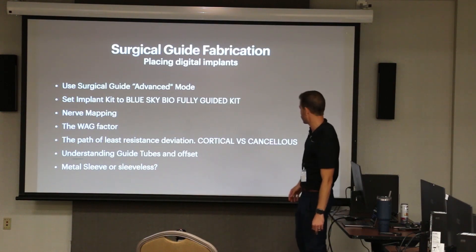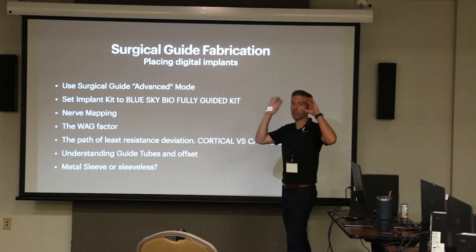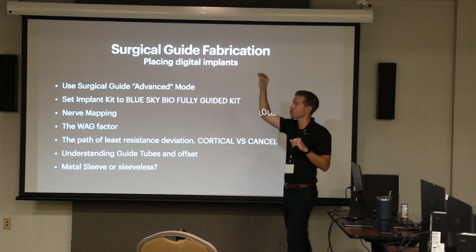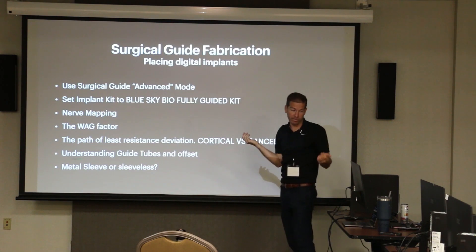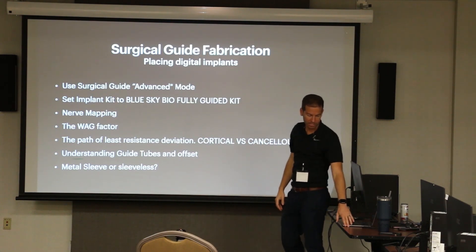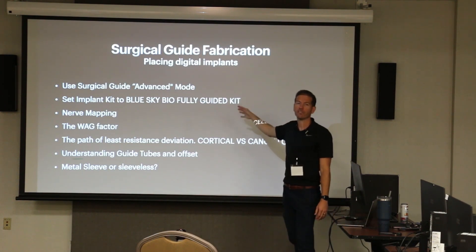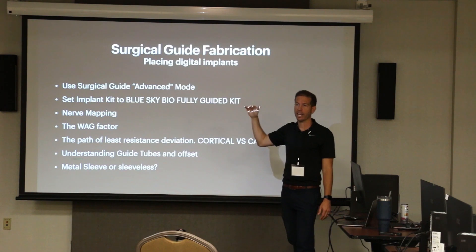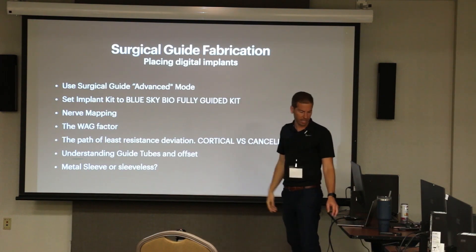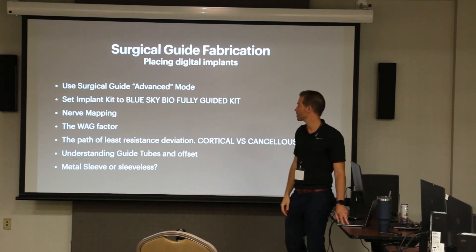A little bit of housekeeping as we think about setting up our cases. I always recommend jumping into the module called Surgical Guide Advanced Mode. I don't find a lot of use for the normal mode — the advanced mode isn't much more advanced, it just adds the important detail of offset that you need. Always set your kit to the Blue Sky Fully Guided Kit if that's what you're using, because it doesn't default to that. If you're using another implant manufacturer, set it to that kit.